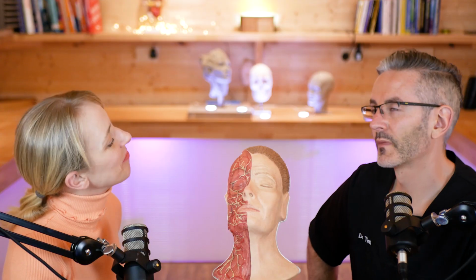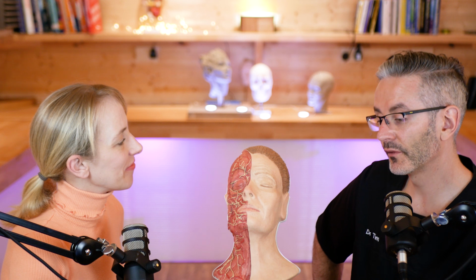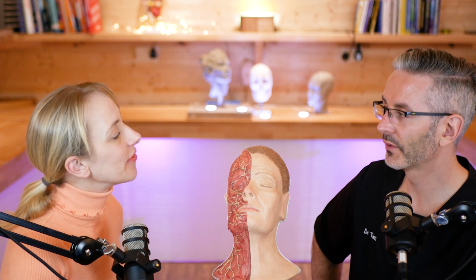So if you could tell us, what mistake do you see injectors making the most, maybe on videos or whatever? Probably one of the more subtle ones that might be worth thinking about. I wouldn't say it's always obvious. It's obvious when I've got an injector in front of me, and it's not that obvious on videos, is depth.